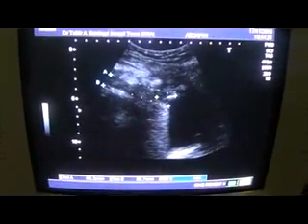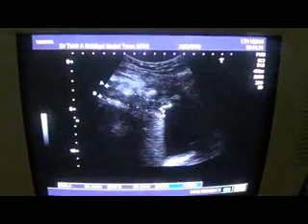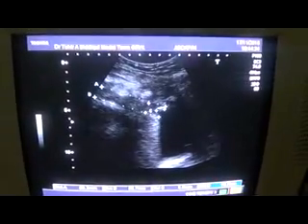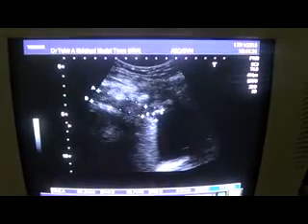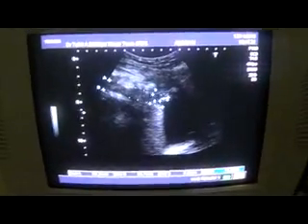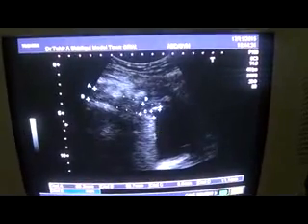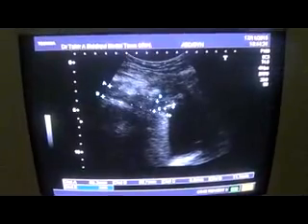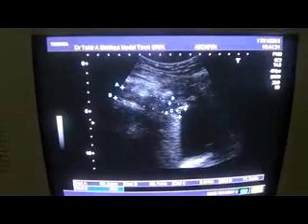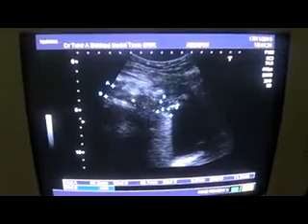Surgically, there has been surgical intervention in this patient. This is all debris, bleed or pus, with this tiny 8.6 mm calcified area within it, which is the cause of back pressure, hydroureter, and massive hydronephrosis of the right kidney. This is the cause. So this is the anterior wall of the urinary bladder, this is the right lateral wall, and here is the insertion of the implanted ureter, which is filled with echoes, measures approximately 11.1 mm, with a calculus at its opening into the urinary bladder, measuring 8.6 mm, along with debris.